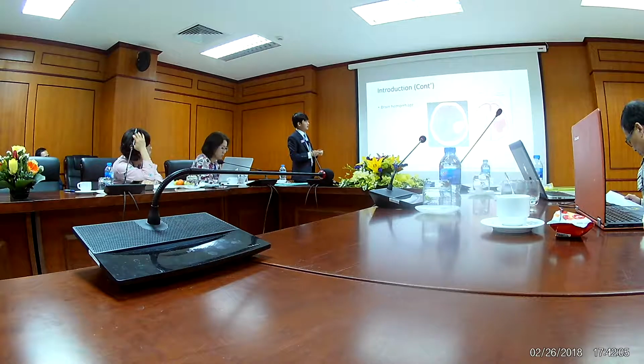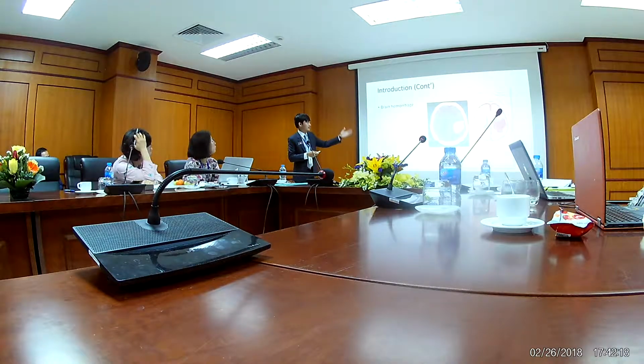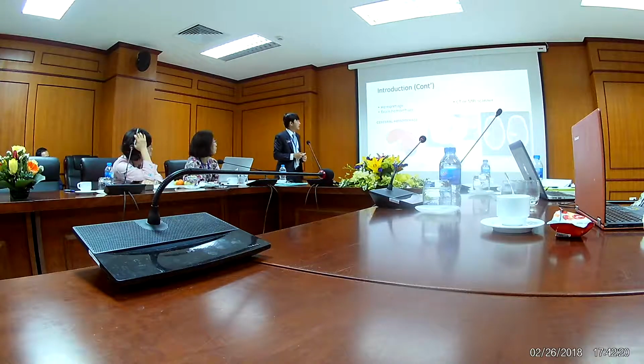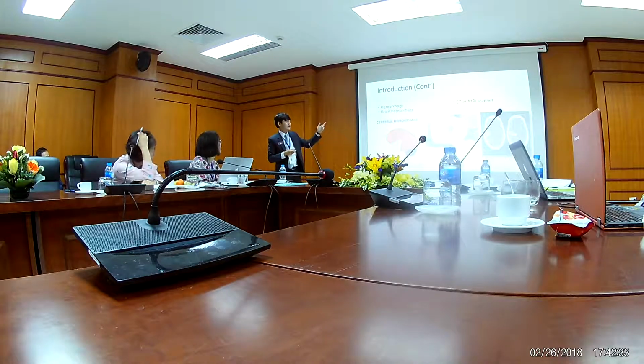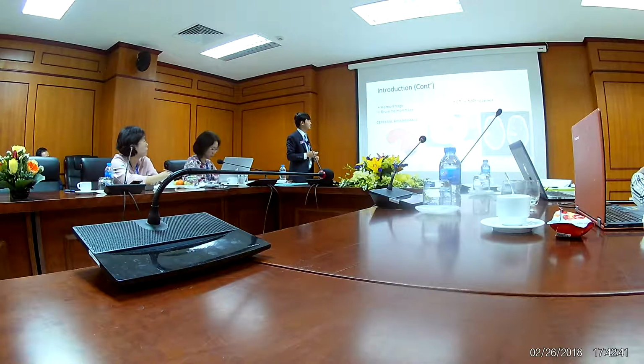This is the CT scan that I get from the CT scan machine, and this is the real one. You can see this is the picture of the brain hemorrhage. And this is some introduction about the machine. There are two ways that we can get the picture that we scan through the head. One is the CT scan, and another one is the conventional one, which is the MRI scanner. So now we are going to work on the CT scanner.